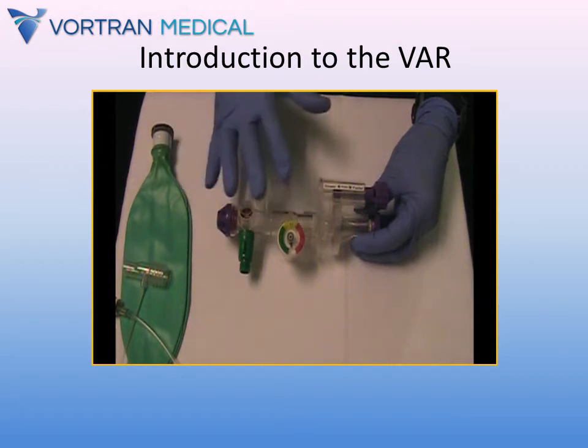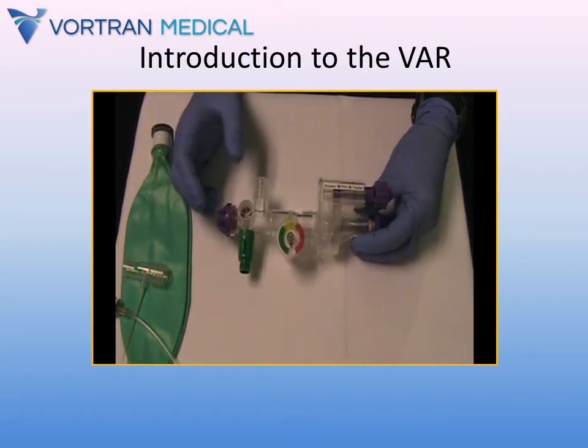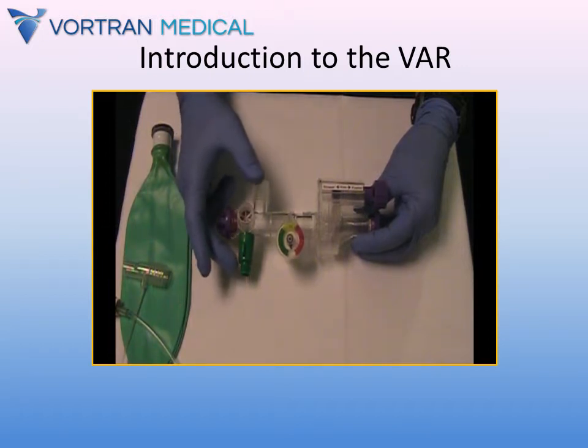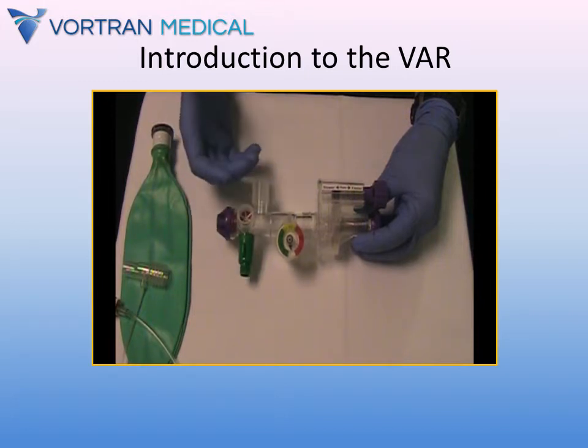Next, we have this purple valve here, which is the pop-off valve. Should the pressure exceed 60 centimeters of water pressure within the airway circuit, this pop-off valve will open and dump the pressure, hopefully saving some barotrauma. Next, we have the ambient air entrainment port. If your patient has their own intrinsic respiratory rate and for some reason you lose your oxygen supply or run out of oxygen, your patient will be able to breathe in outside ambient air.